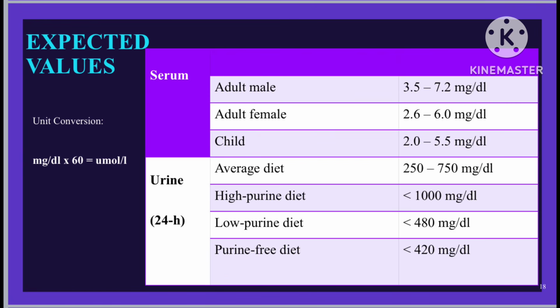In the laboratory class, we also do a 24-hour urine test for uric acid concentration. This test is a significant diagnostic tool used to evaluate how much uric acid the body produces and excretes over a full day. This test also provides more accurate and comprehensive information than a single random urine sample, since we know that uric acid levels can fluctuate throughout the day depending on diet, hydration, and metabolism.